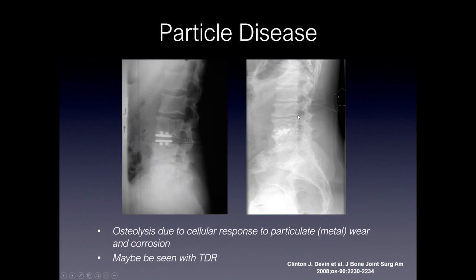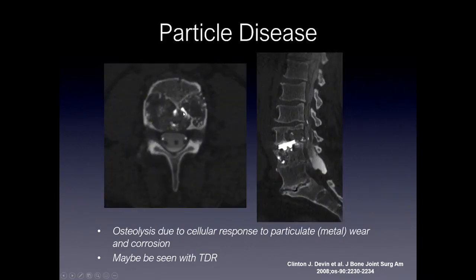Particle disease is a very rare event reported in the literature. It's an osteolysis due to cellular response to particles from wear and corrosion, and it can be seen with total disc replacement. In this example, you can see a total disc replacement with significant collapse and hyperdense material within the vertebral body. On CT, you can actually see migration of these little metallic particles within the vertebral body, which incites an inflammatory response and causes osteolysis, with metal shavings migrating into various areas around the construct.